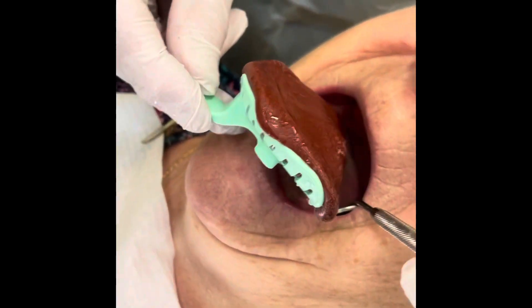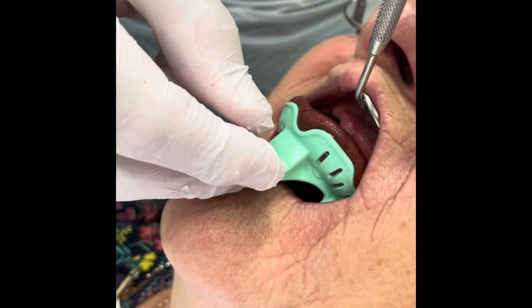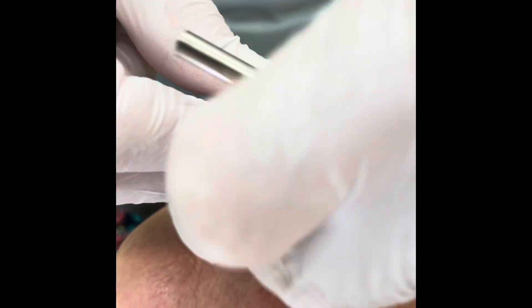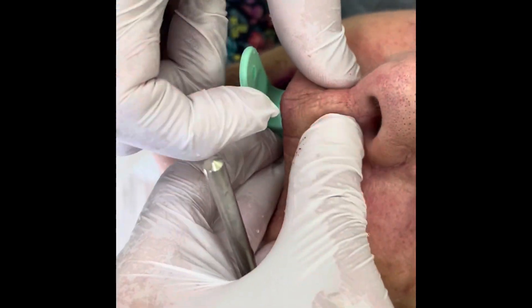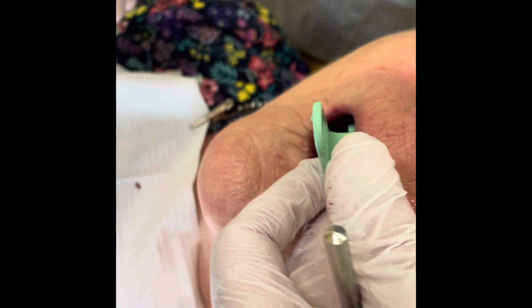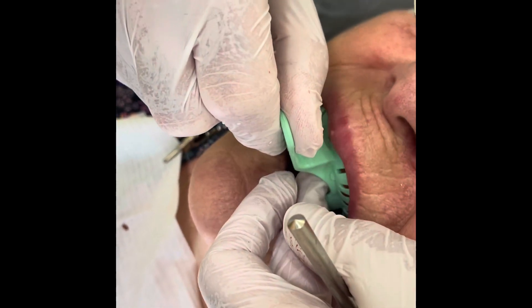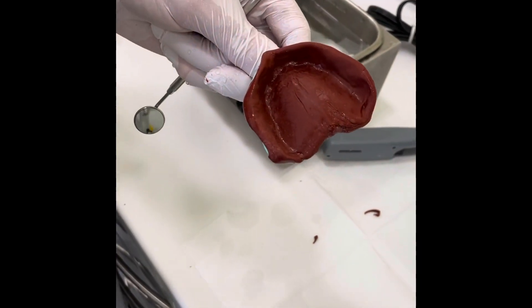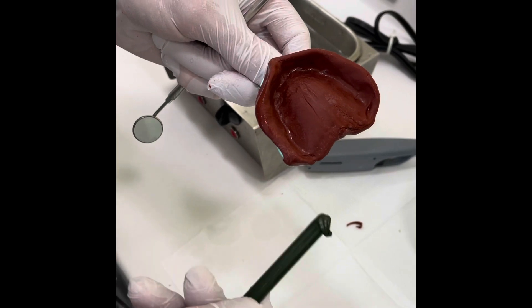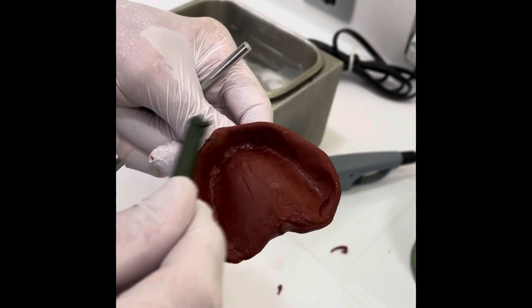Upper's from behind — seat the tray, watch it go over the ridge. Central pressure, and this is the critical bit: thumb and forefinger, squeeze the top lip, watch the patient's eyes. Can you move your chin left to right? So we're slightly short to the tuberosity — this is normal. I always do green stick up there to make sure you've got the right depth.